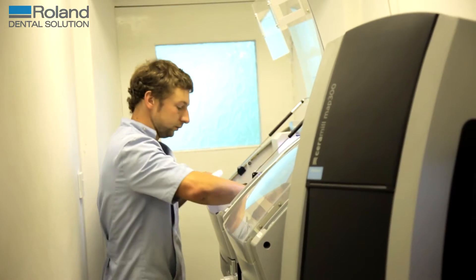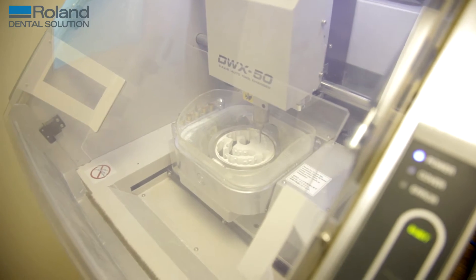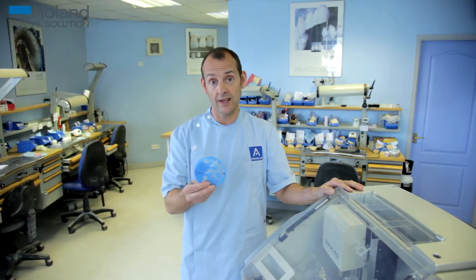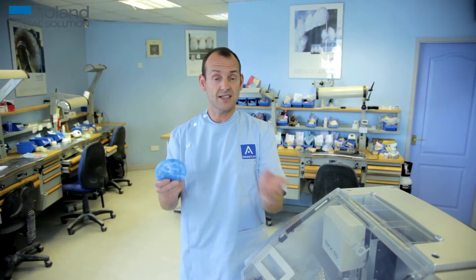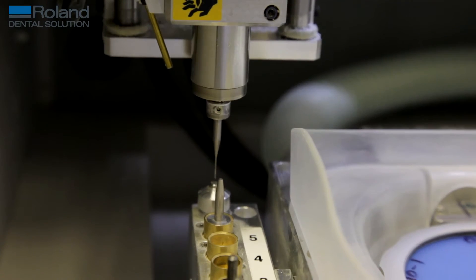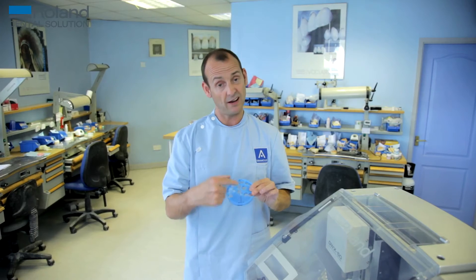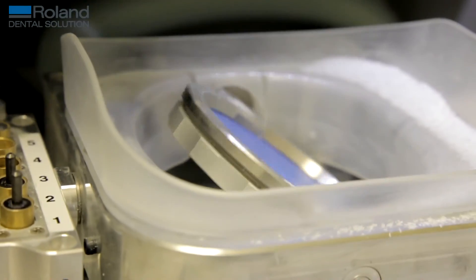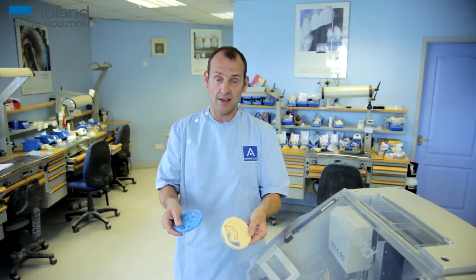You just take your disc out and there are your jobs. It's not the case that you can only use your disc once — if you've only got a few, like in this case there's only four on this, it'll mill four out for you. You can take that disc out and the next time you've only got a few, this isn't wasted — you use this again. Just make sure you position it in the same place; we put a line down the front to make sure it goes in the machine in the same position.